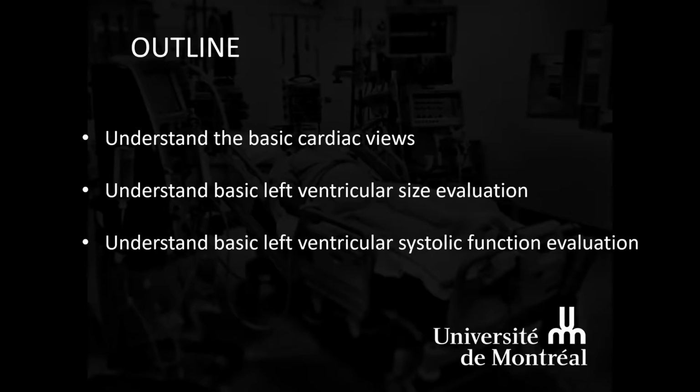At the end of this video, you'll be able to understand the basic cardiac views, understand the basic left ventricular size evaluation, and understand basic left ventricular systolic function evaluation. Please note that we will not be going into details of LVEF assessment. You can refer to the 2D LVEF pitfalls for nuances of visual LV assessment. The different quantification methods will be covered in our more advanced LV assessment videos.